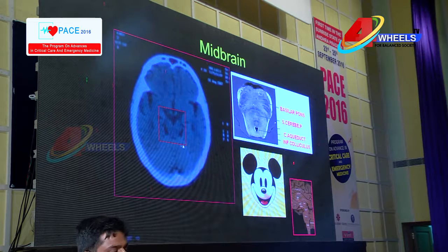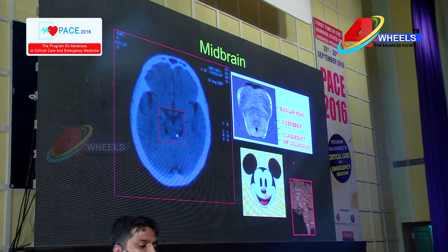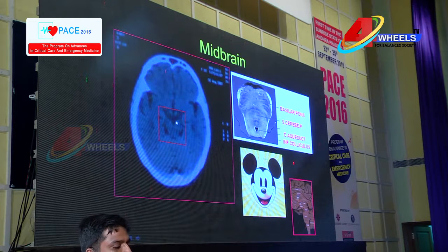So that's why it is quadrigeminal colliculi, and the cistern which surrounds this is your quadrigeminal cistern. Now anteriorly again you get a cistern, and that is your suprasellar cistern. This is a star-shaped cistern where your circle of Willis stays. At the same time you can see this is a W-shaped cistern.